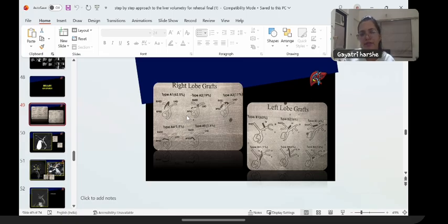They put the graft as a portal vein because there will be portal vein atresia, and that particular portal vein will not be useful for anastomosis per se. So for the graft purpose as well as for the length, in biliary atresia cases, we need the diameter. It is not actually a thrombus, but an atretic portal vein. So for the graft per se, we need the diameter of the portal vein.